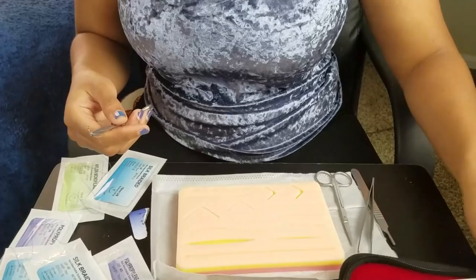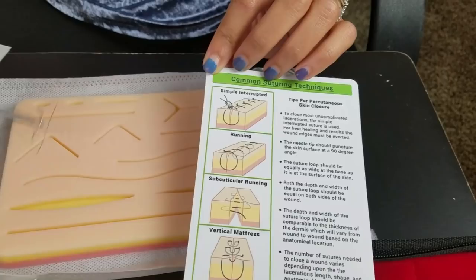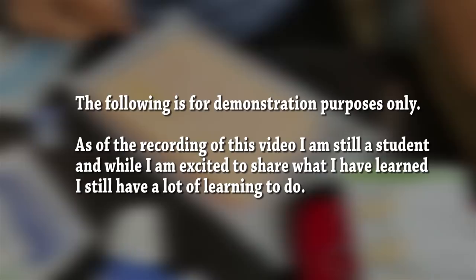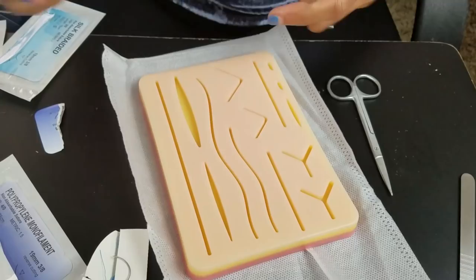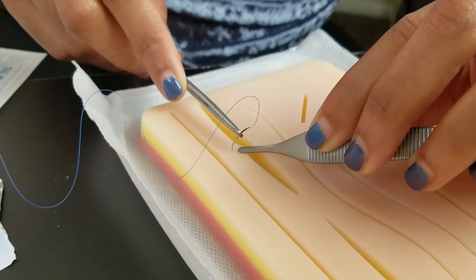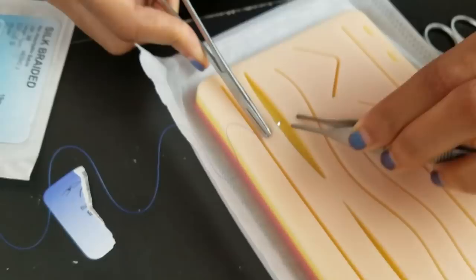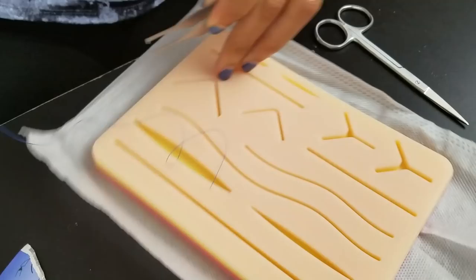Okay, so let's just do a simple interrupted for you guys. The simple interrupted is literally going in one side of the laceration, coming out the other side, and then tying the knot. So that is what I'm going to do. I'm going to need my needle, my pickups, and my scissors. These are really good on these kind of straight lacerations. Usually they always tell us to go into the middle, not always the case when dealing with real tissue and real lacerations.